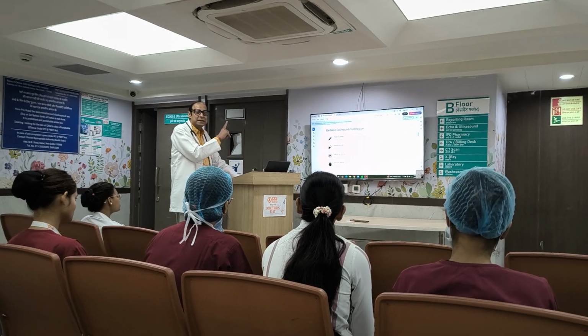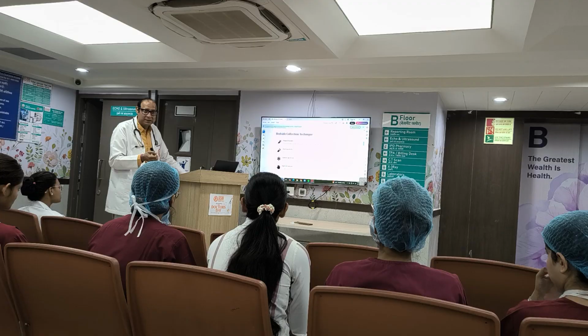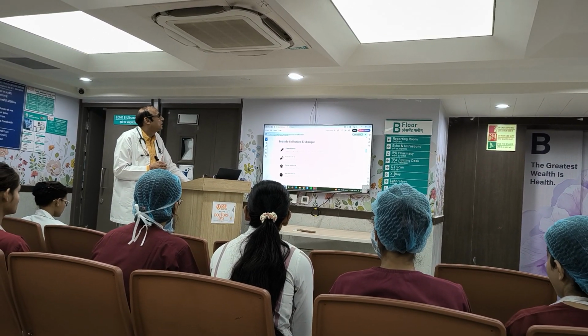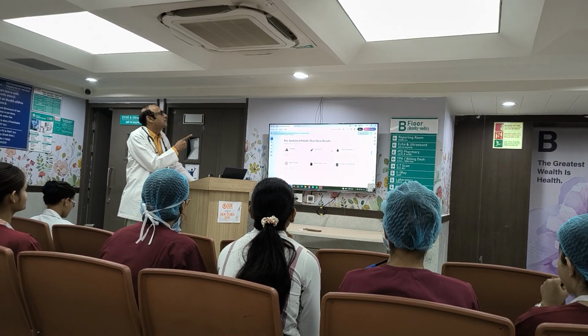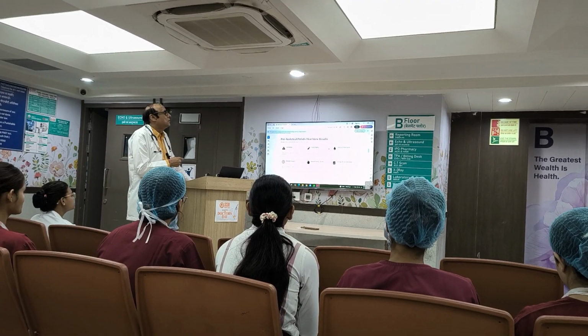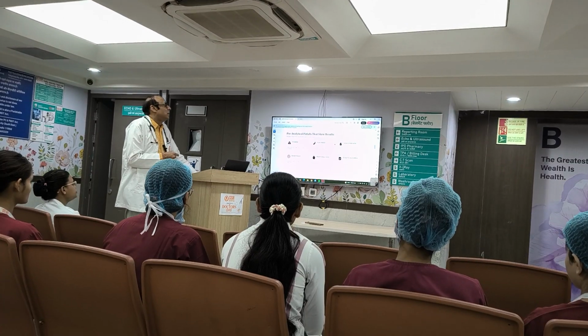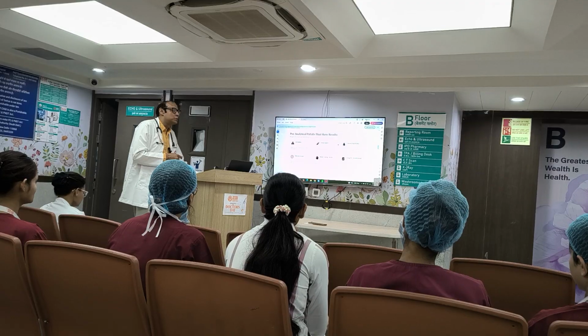So this is the way. Last time in the hands-on we did how to take the sample and everything, so I will not go into detail. You have to remove air bubbles. Excess heparin we cannot accept. Venous contamination, delayed transportation, breath holding and anxiety. These are the pre-analytical pitfalls that affect the results.